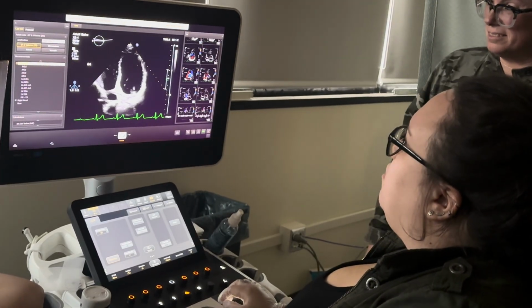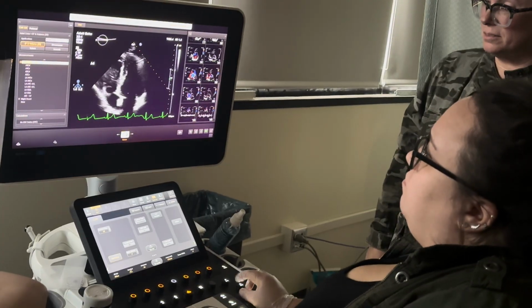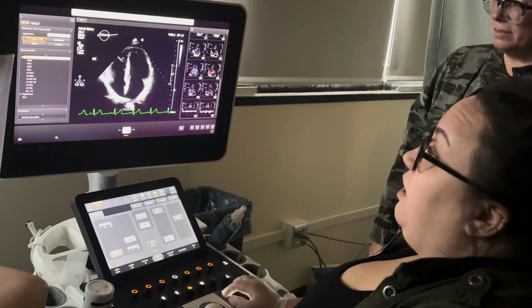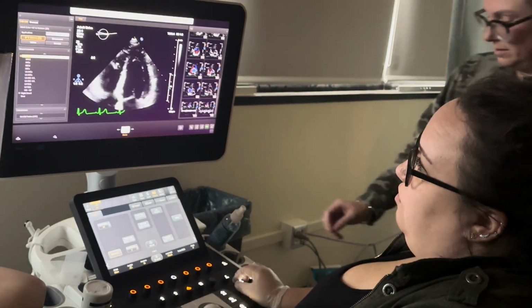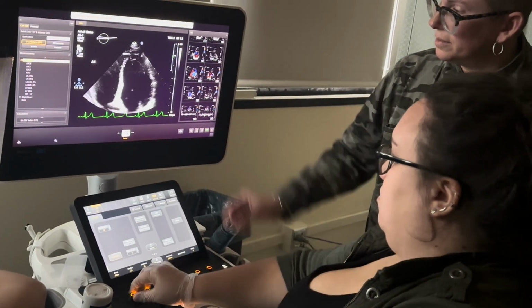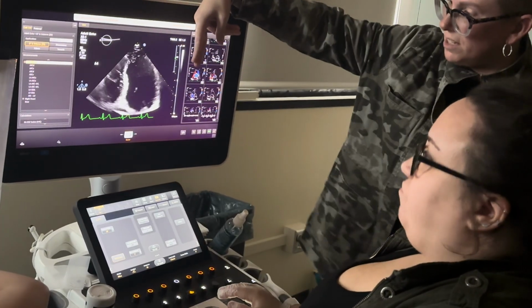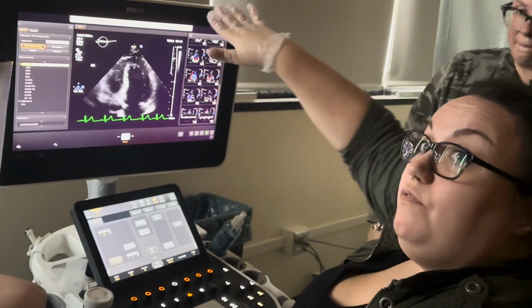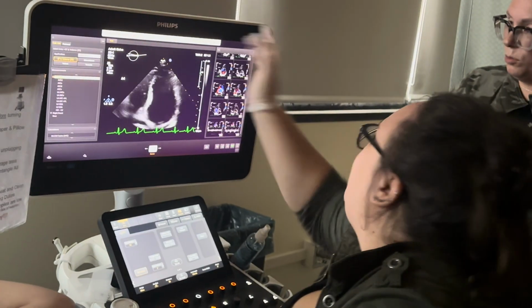A little foreshortened though. There you go. So watch. I was up here. These are really pretty pictures, but look at that apex. Look at how that apex is coming down into her cavity. Here, pull the focus into it too. And also, let's see how this rose comes down. We don't want that. We want it to be a V, because this is not giving us an accurate view of the apex. This is what we call a foreshortened apex.